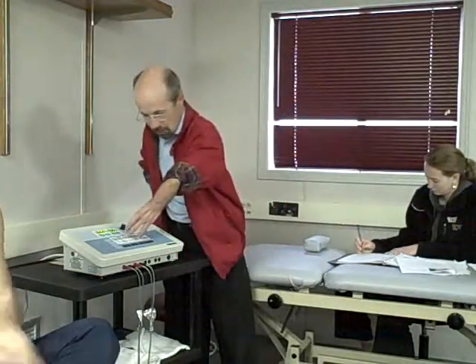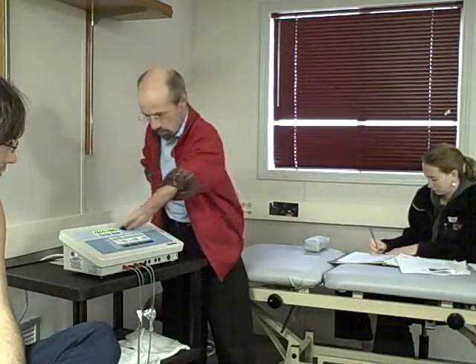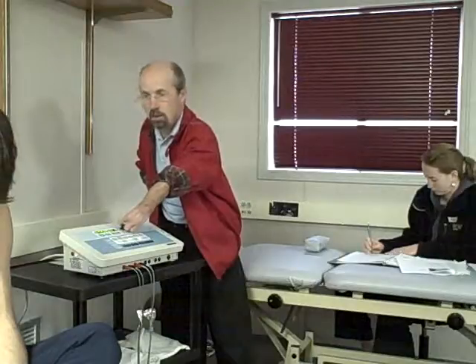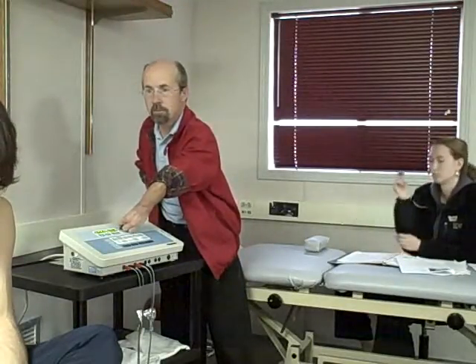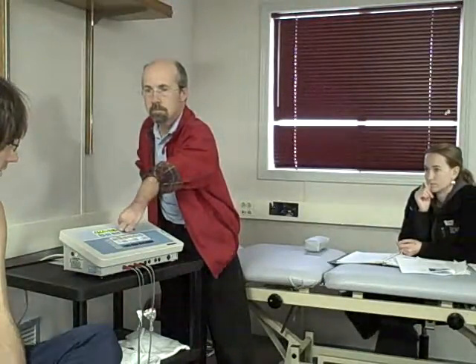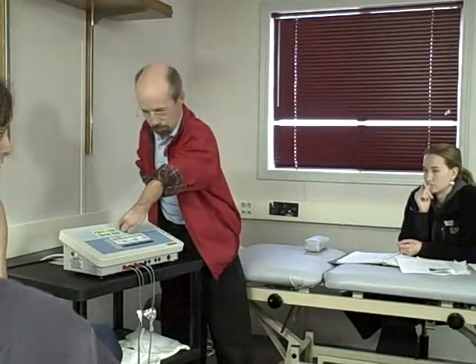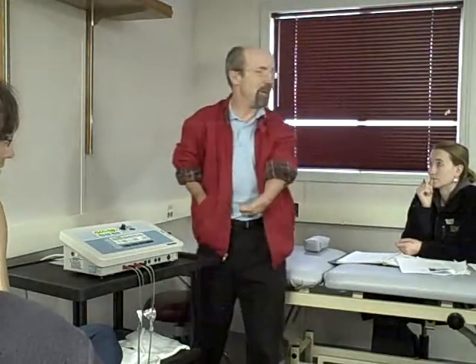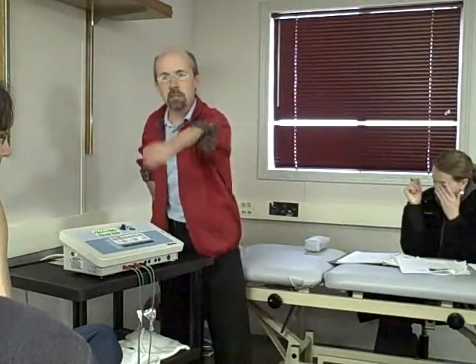Okay, so again, the idea is pretty much the same. You just press pre-mod, set the intensity. I took care of that for you. Just turn on. Tell me when you feel something. We'll get to that. Slight tingle there. So is that just coming out of channel 1? Channel 1. Yep. Correct. Just channel 1. I just didn't kill the others off. So that's it. Hit the waveform, set the intensity, and go.